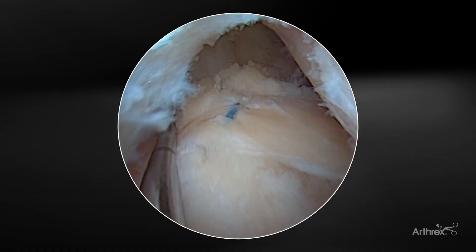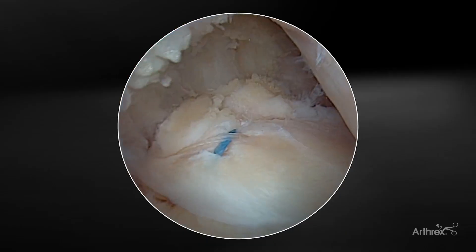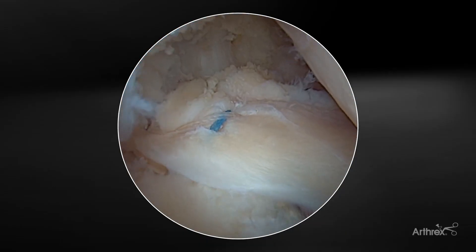One last thing to do is just to probe it and assess the overall tension on the repair. You can see nicely that the meniscus has been re-approximated back to the root.